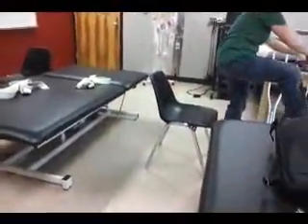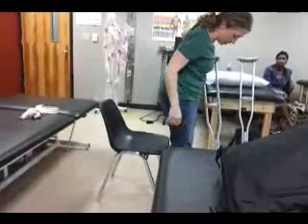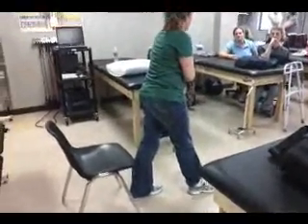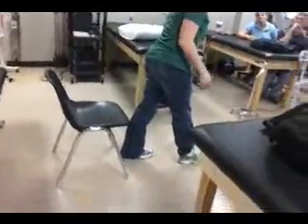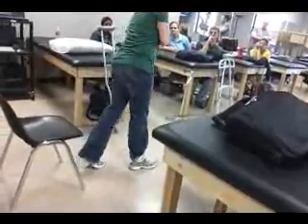Sorry, I'm going to get my scrunchie so everybody knows which is my bad foot. Can I use this for a non-weight bearing pattern? No. Only for full weight bearing. But I have one leg that's bad. So, my crutch goes, then the bad leg, and my crutch is always opposite of my bad leg or my assistive device. Why is that? Balance. It helps with balance, it widens my base of support, and because I can't stand the full weight on this, I can shift it off of that.